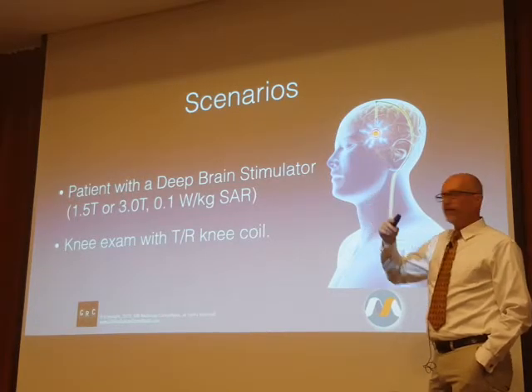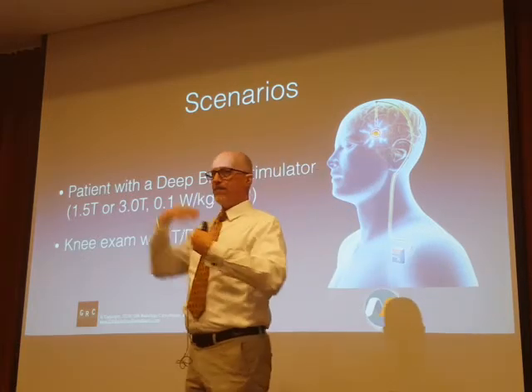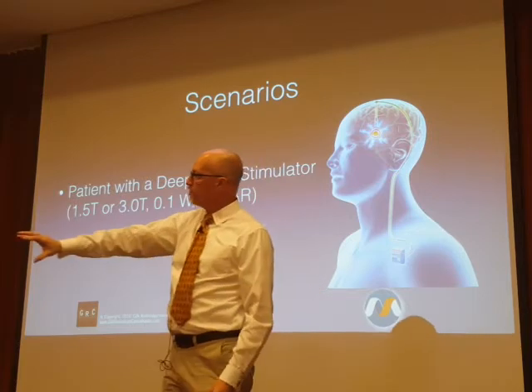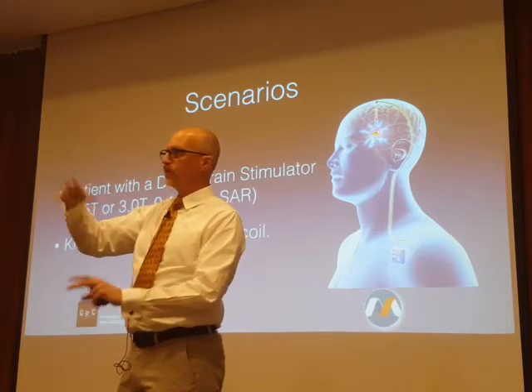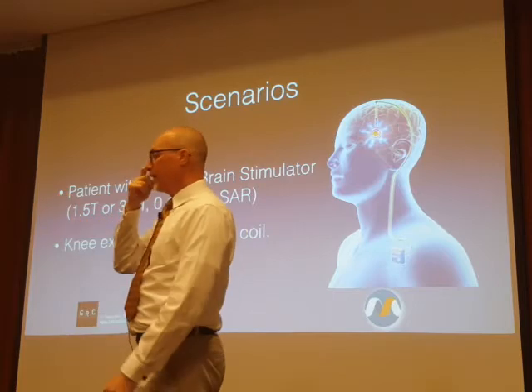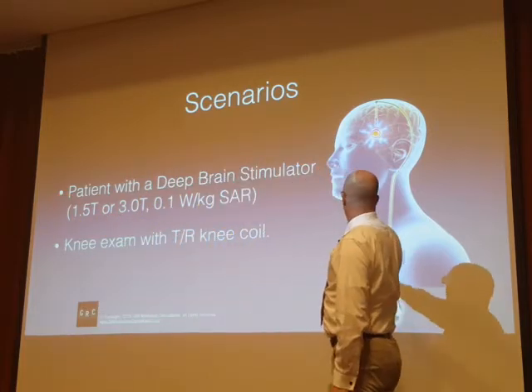Yes, we are a little bit, because if we put them in head first, we know that the part with the implant, the deep brain stimulator, is going to pass through the mouth of the bore where the static field is the greatest. When I showed you before, those little white areas where your 3T is actually 3.6, the US FDA says that's not important, don't worry about that.